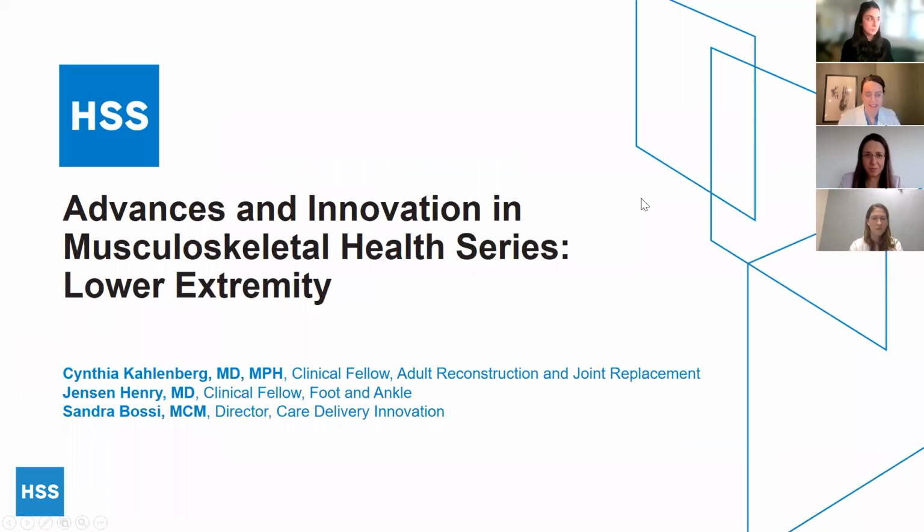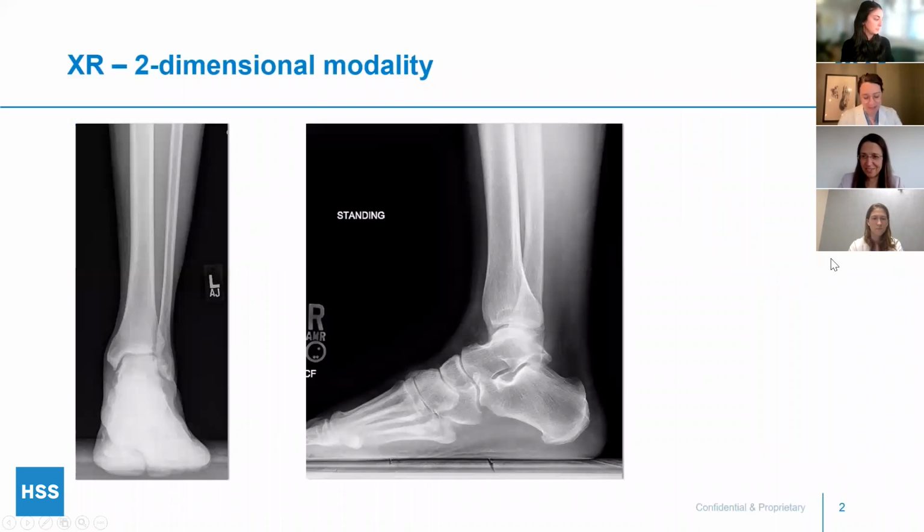Yes, that's fantastic. This is a major absolute passion of mine. And so when we get x-rays, they're a workhorse in orthopedics. Whether you're going to see someone for your hip or your foot or your shoulder, we always get x-rays, and they provide a wonderful view and alignment of the bones.